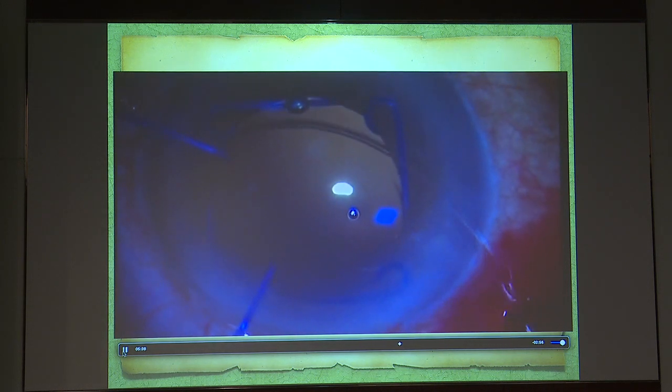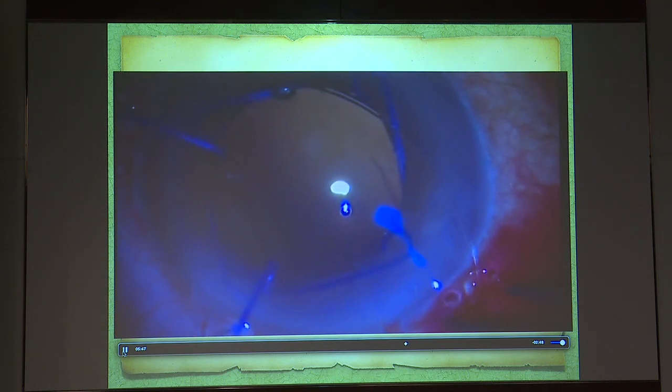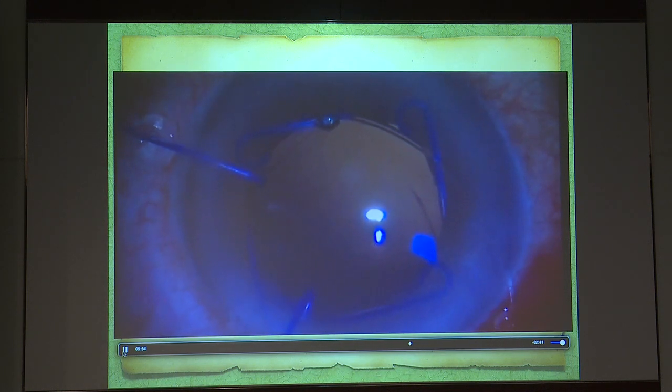There are two types of capsular hooks. These capsular hooks which I use are made by Madhu, no financial interest. They don't have a large area of hook in the periphery, but some of the capsular hooks which cover a larger area of the equator have a loop, and that's where you have to be even more careful.